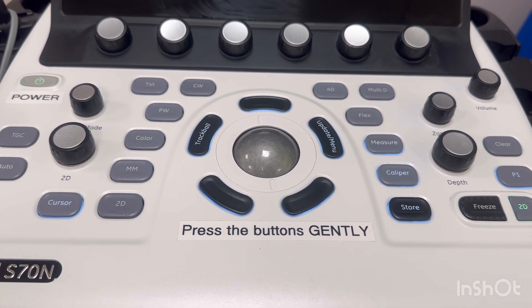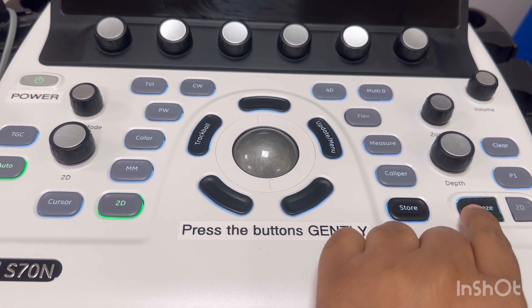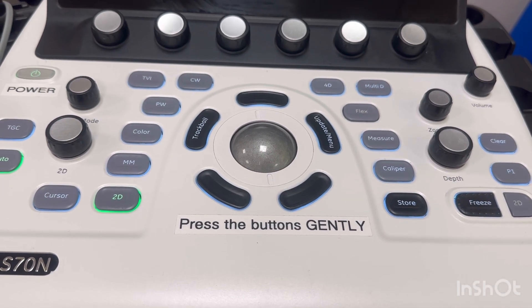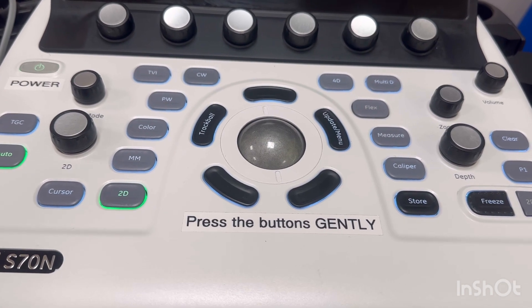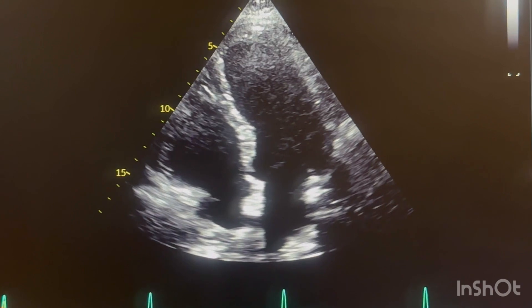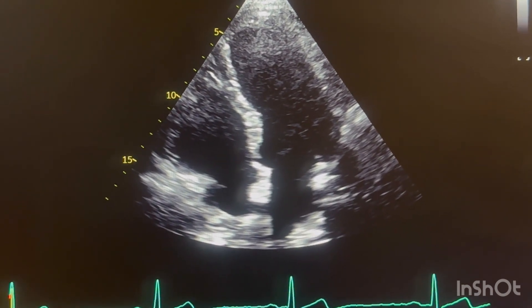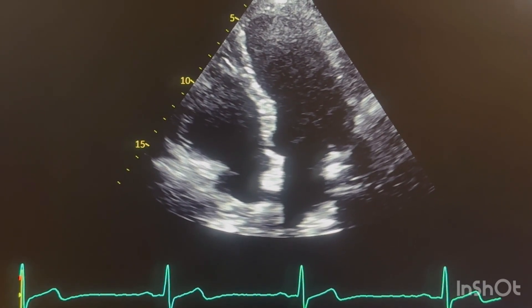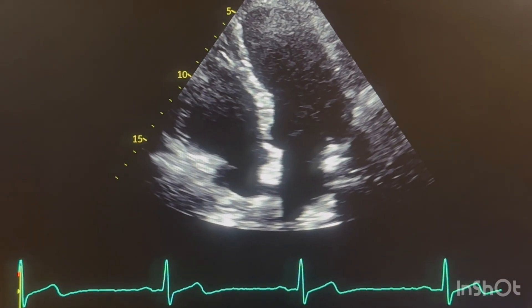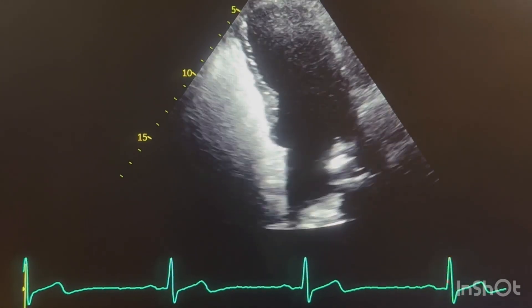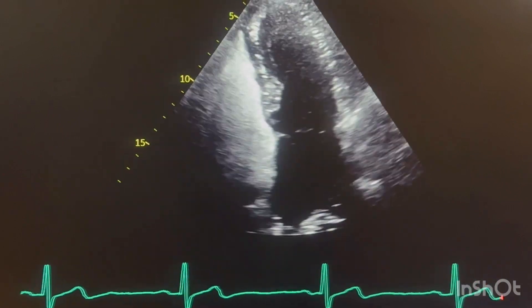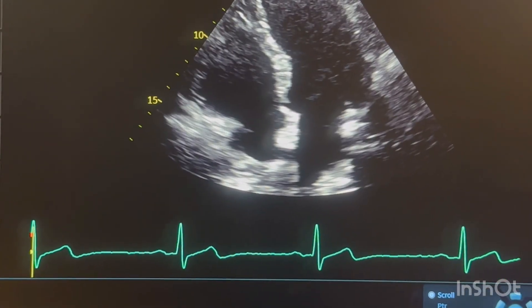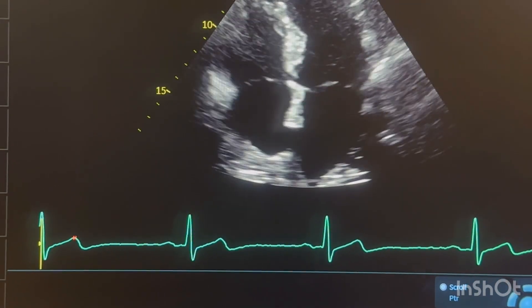So whenever you are ready, press the freeze button — it will turn green — and then unfreeze it. This resets your cycle on the machine back to zero. Then ask the nurse to inject. Once they inject, you will see the empty right heart first, and then the bubbles coming into the right heart. Let the recording run, and once you see bubbles appearing on the left side, let a few more beats pass and then press freeze to review.